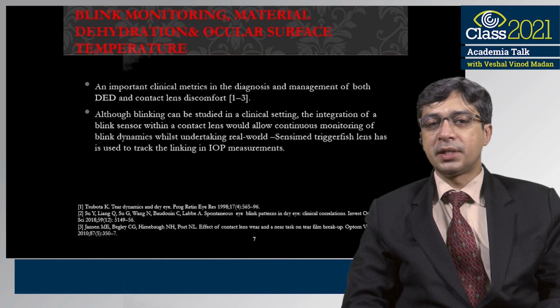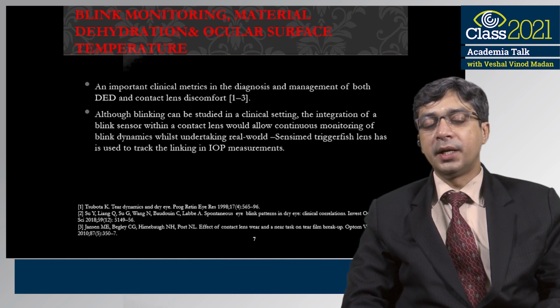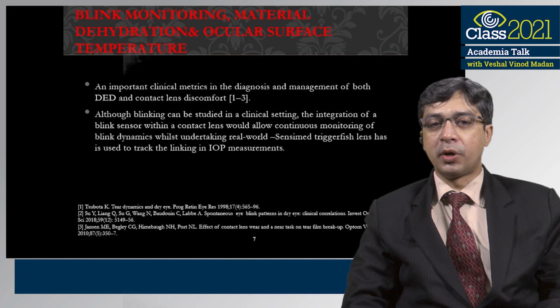As far as contact lenses are concerned, there are further enhancements which can be used. Not only can they measure and monitor and aid in diagnosing inflammatory markers, but they can also be used to monitor the blink of a person, if blinking is the culprit.